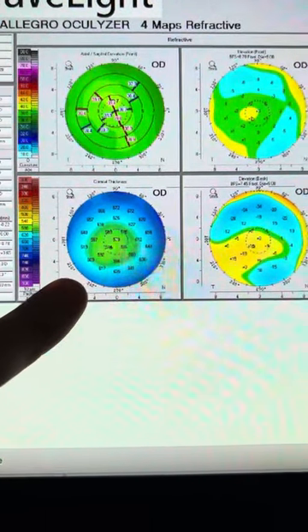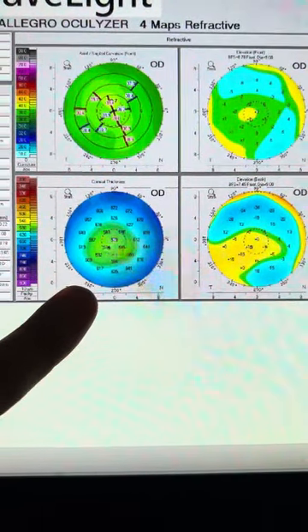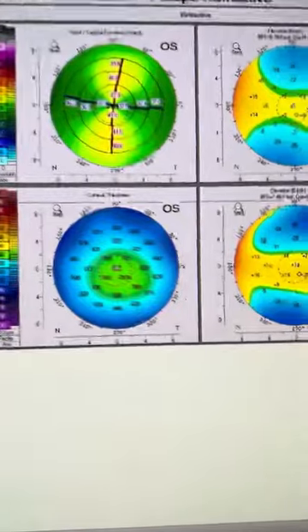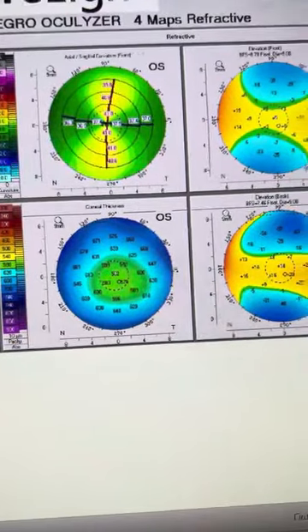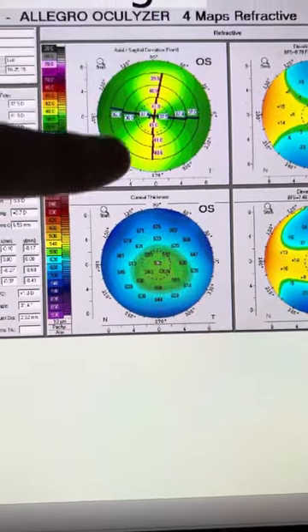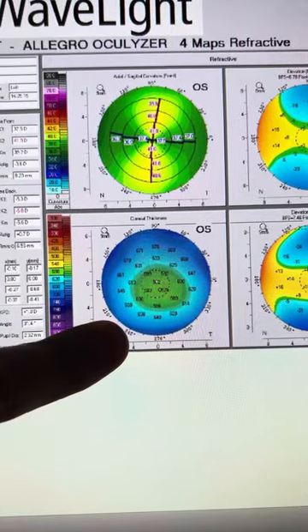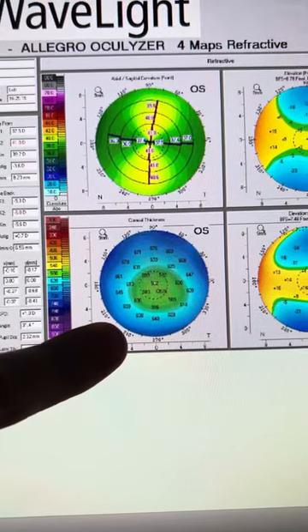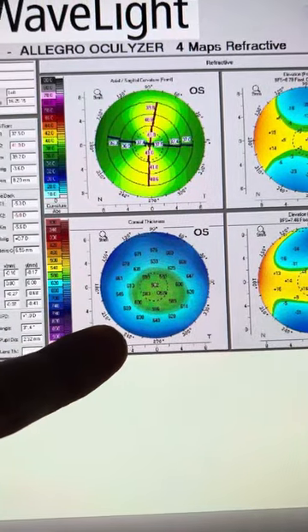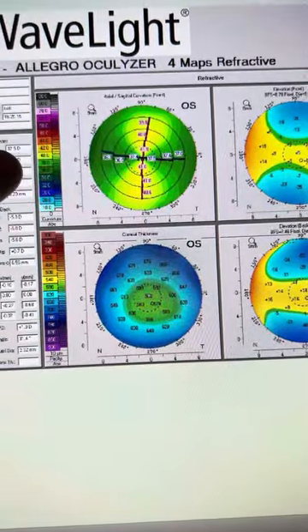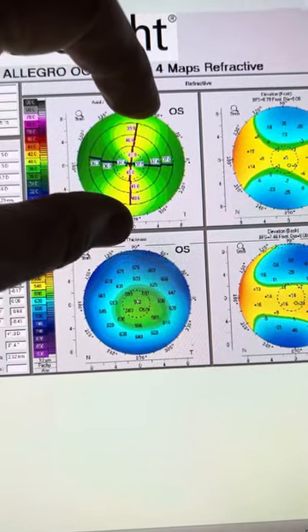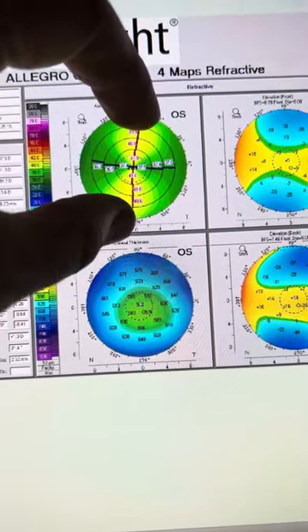We're seeing his right eye, the pachymetries are impeccable. We're seeing the left eye that gives away the very high astigmatism, and the fact that the pachymetry is exactly the same. So the astigmatism is a product of this dimension of the cornea being much shorter.